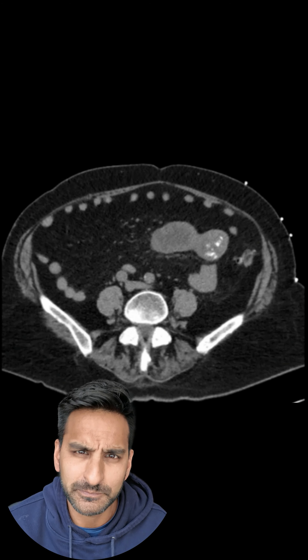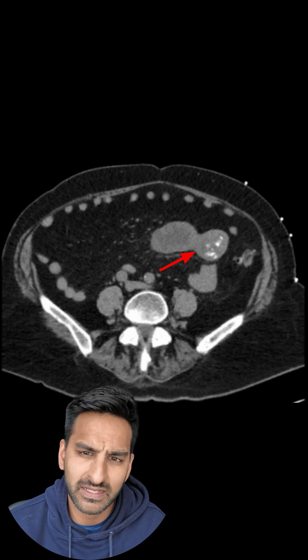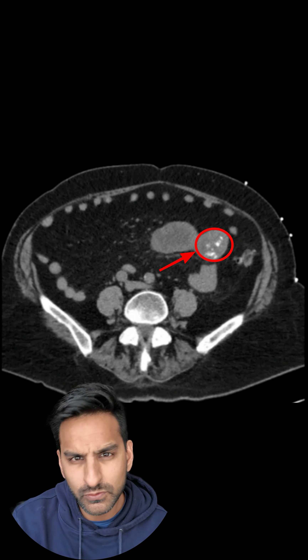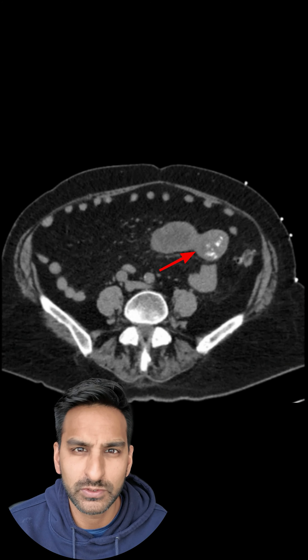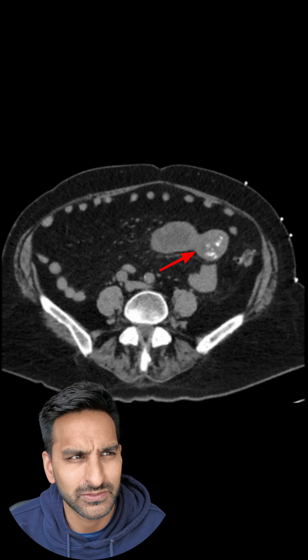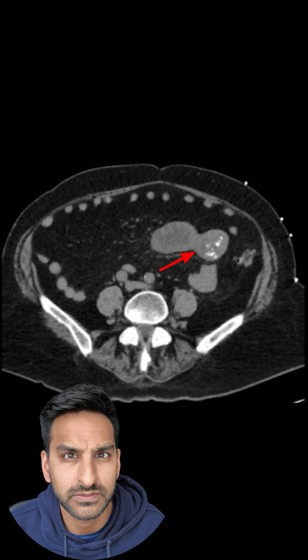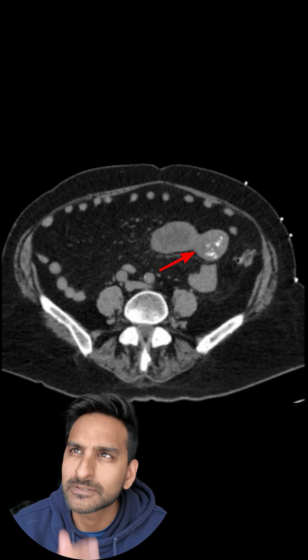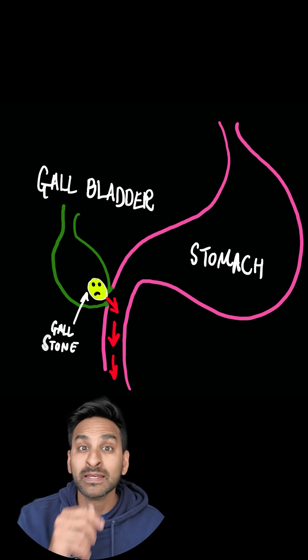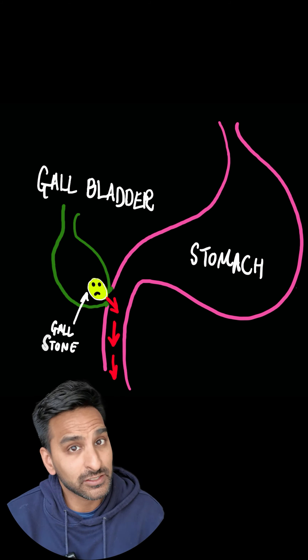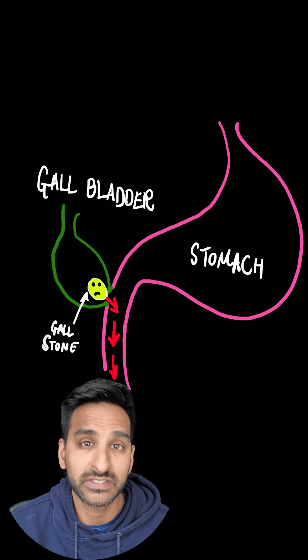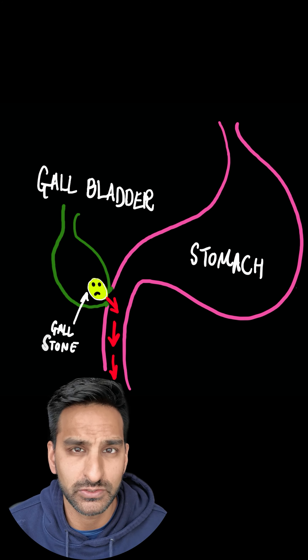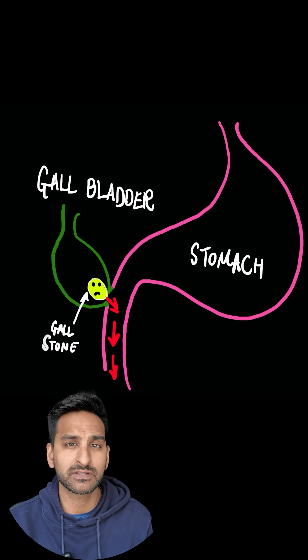This case is a non-contrast CT scan of an adult patient who's come in with abdominal pain. As you scroll through it, you realize it is non-contrast. Coming further down, you can see there is an extensive amount of dilated small bowel. What could be causing that? You start thinking along the lines of: is this obstruction? Is it not obstruction? What on earth is going on?